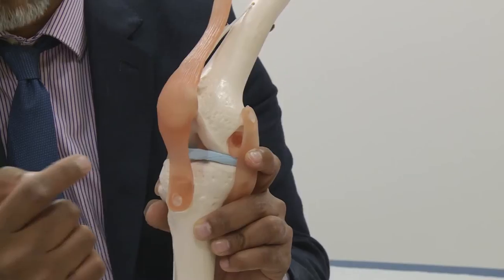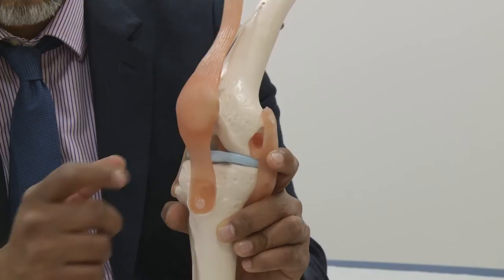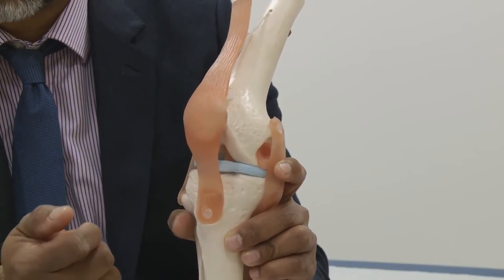We use instruments through that incision to perform the procedure. If cartilage needs to be removed we do that, and if there's a loose body in the knee that needs removing, we'll do that as well. At the same time we look at the rest of the articular surfaces and anything else that needs doing is done at the same time. The whole procedure takes roughly about half an hour to 40 minutes.